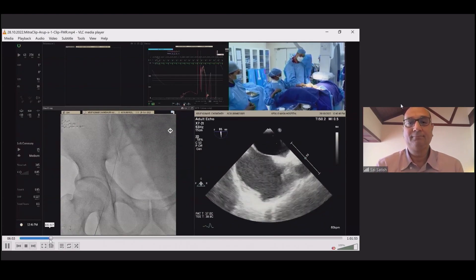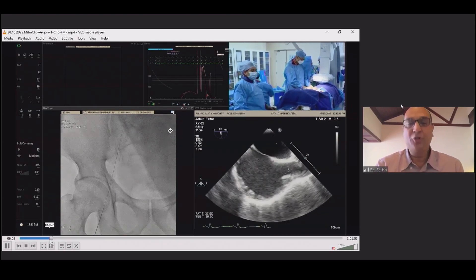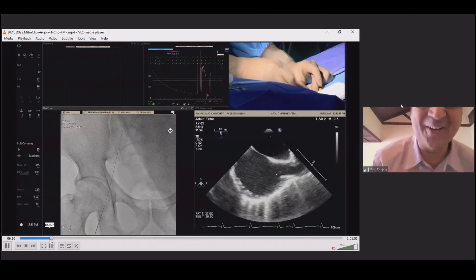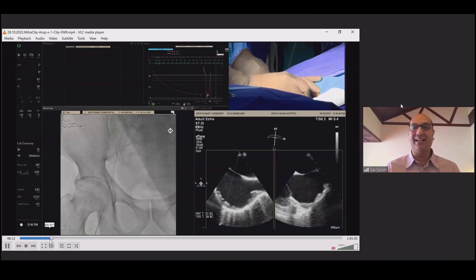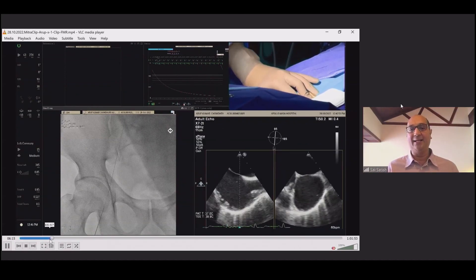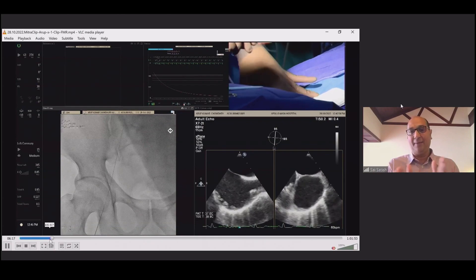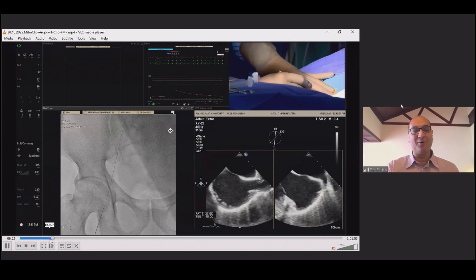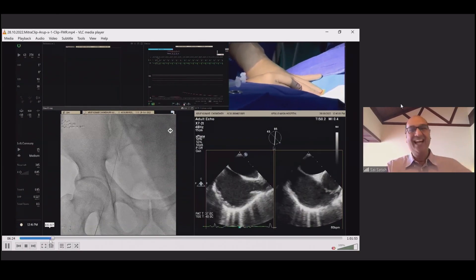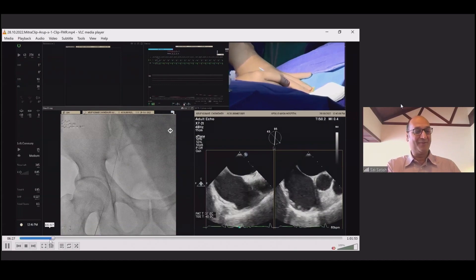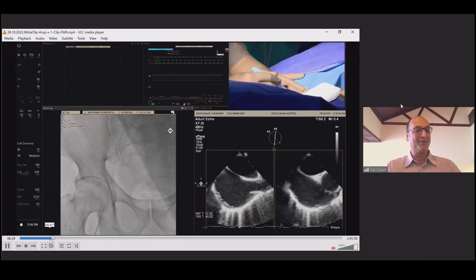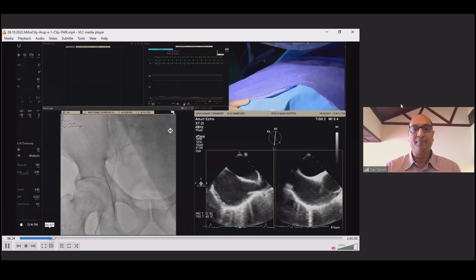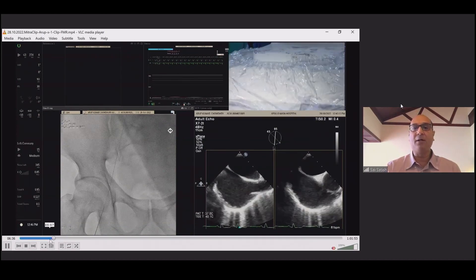Do you have a good TEE image showing the severe MR? The reason I flip through is that the minute I finish the puncture and the transseptal, the MR assessment is much better in this video because this was a quick case. So, bicaval for transseptal puncture — after the Perclose is in — the minute I'm in the right atrium, 3,000 units of heparin is given.